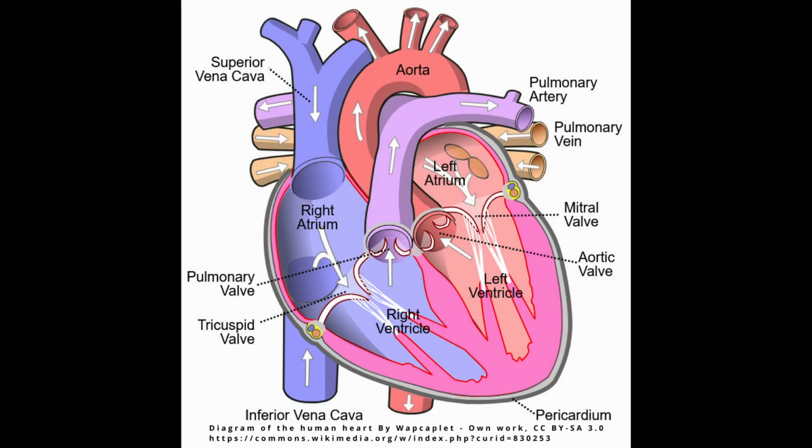Here we have a diagram showing the circulation of the heart anatomy. This is the general path that the wedge catheter will take as you're using it. You can see that venous blood returns to the heart via the superior vena cava and the inferior vena cava. Common access sites when doing a wedge catheterization are the internal jugular vein in the neck, the brachial vein in the arm, which will both come into the heart via the superior vena cava, and the femoral vein, which will come in through the inferior vena cava.